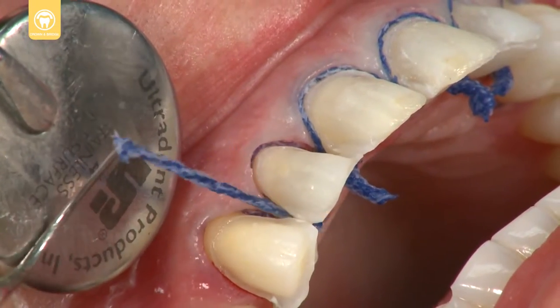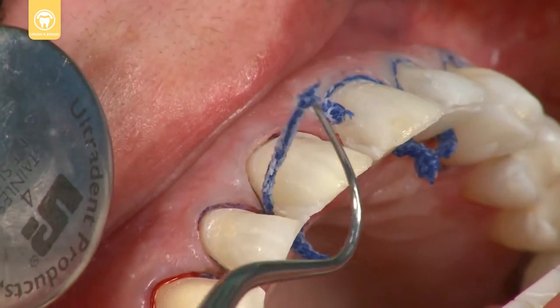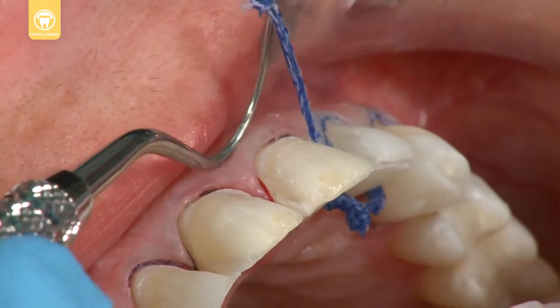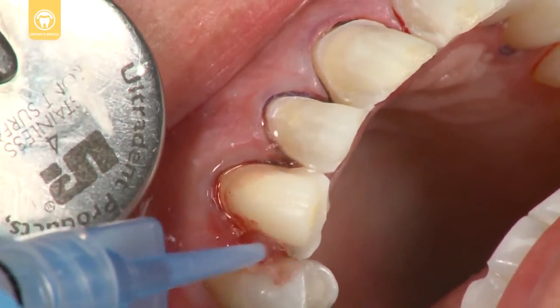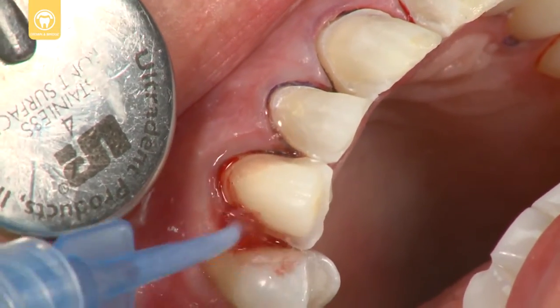After hemostasis is achieved, remove the larger cord prior to making the impression. After the cord is removed, use ViscoStat Clear for additional control of bleeding and sulcular fluids.